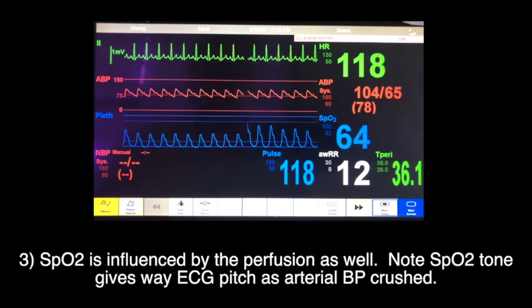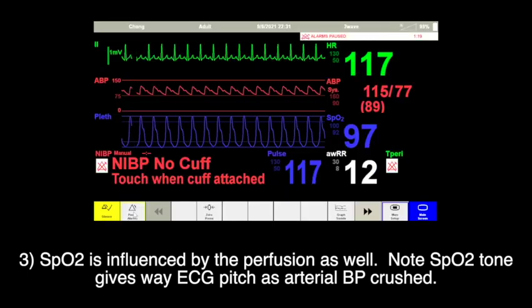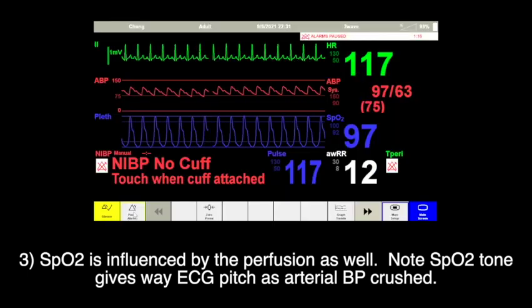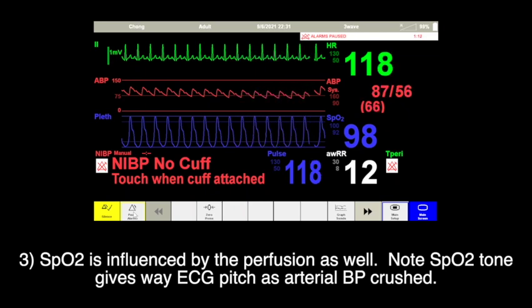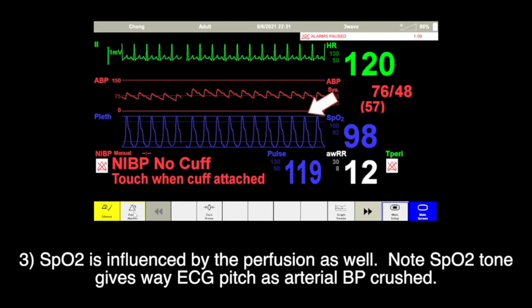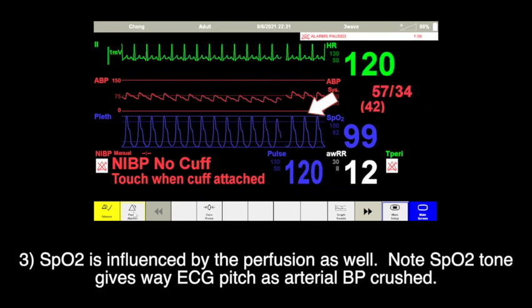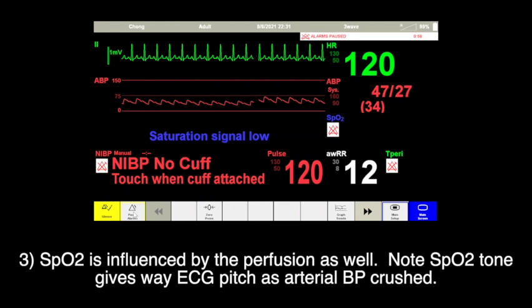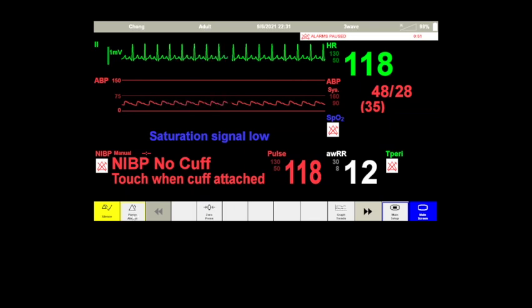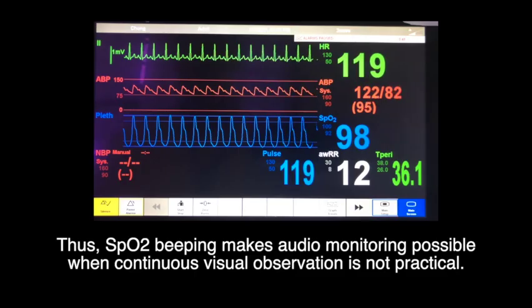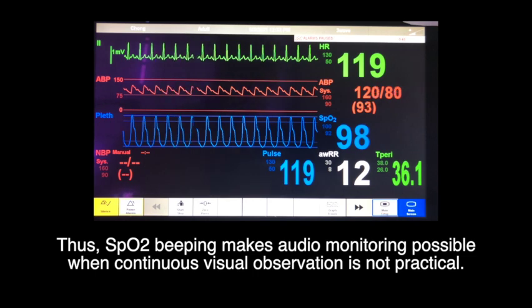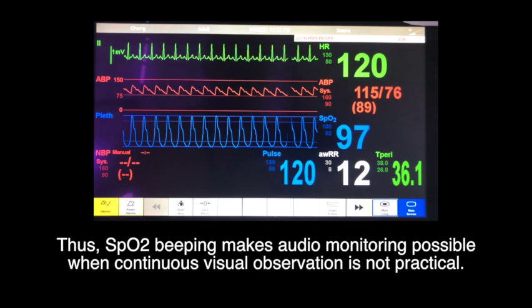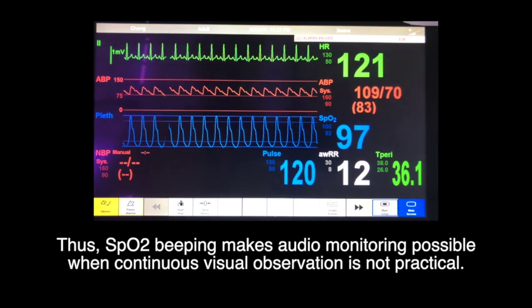Third, SpO2 is influenced by perfusion as well. Note the SpO2 tone gives way to ECG pitch as the arterial BP crashes. SpO2 beeping makes audio monitoring possible when continuous visual observation is not practical — for instance, when performing a physical assessment or administration of medications.